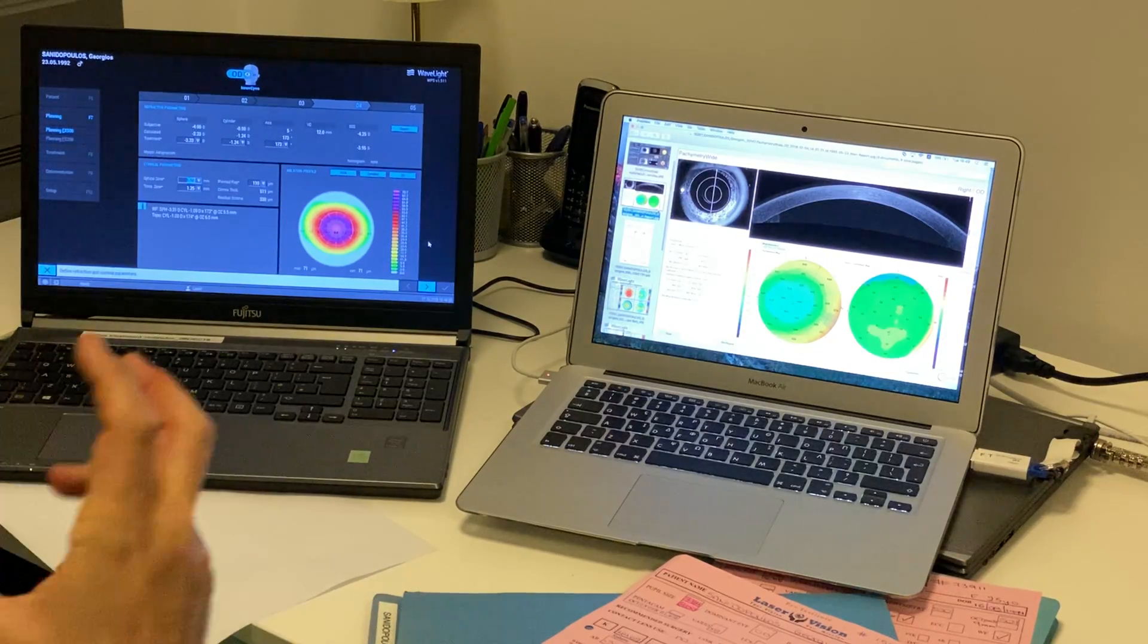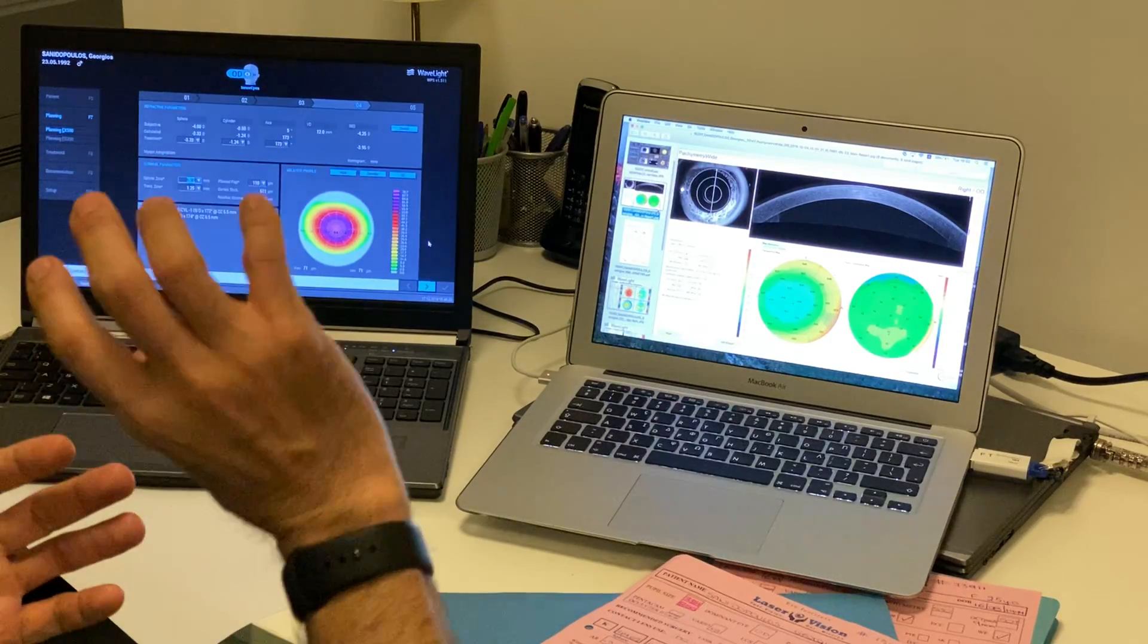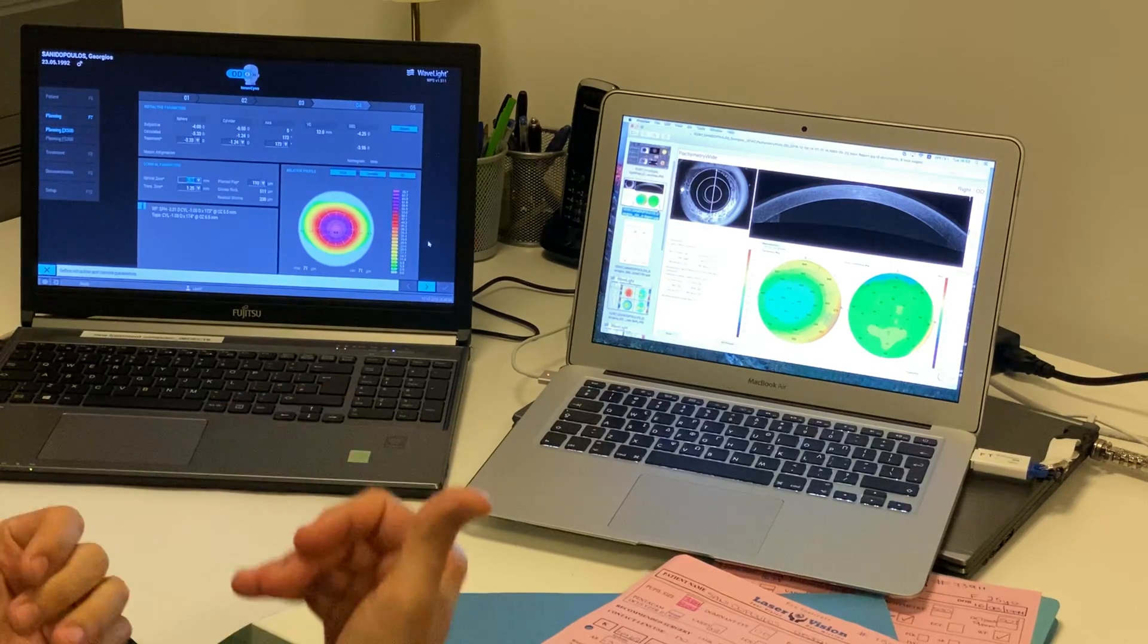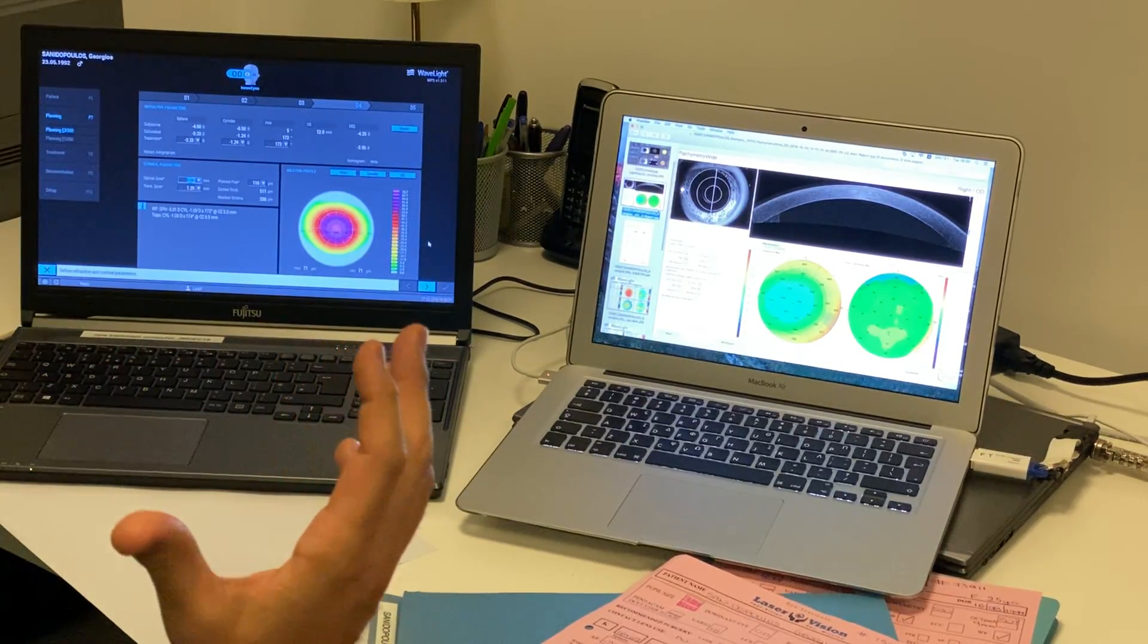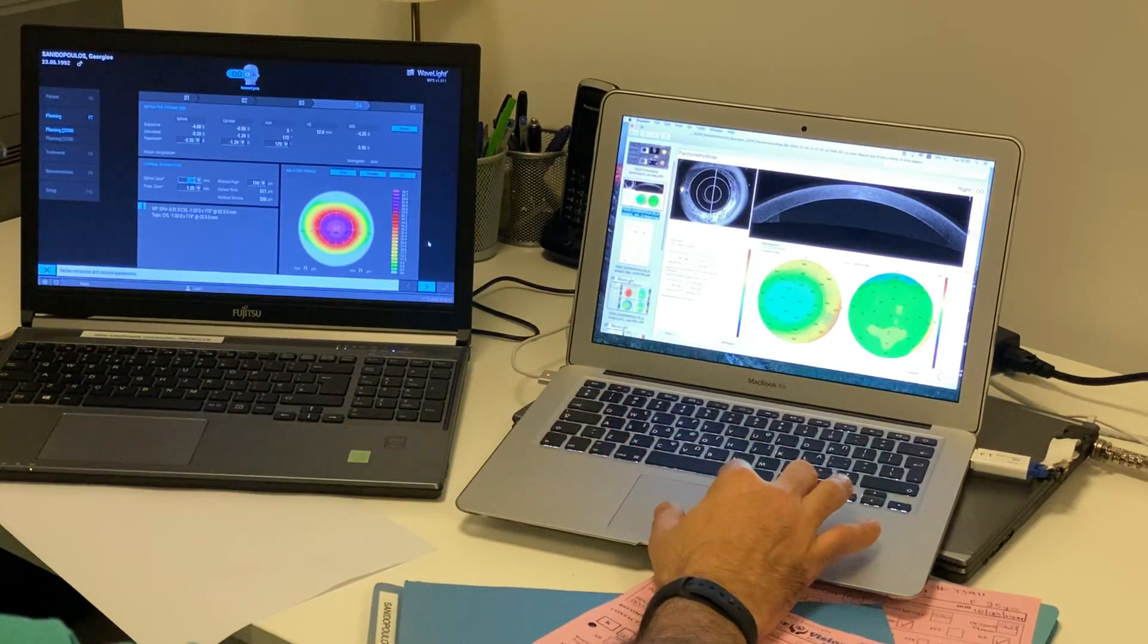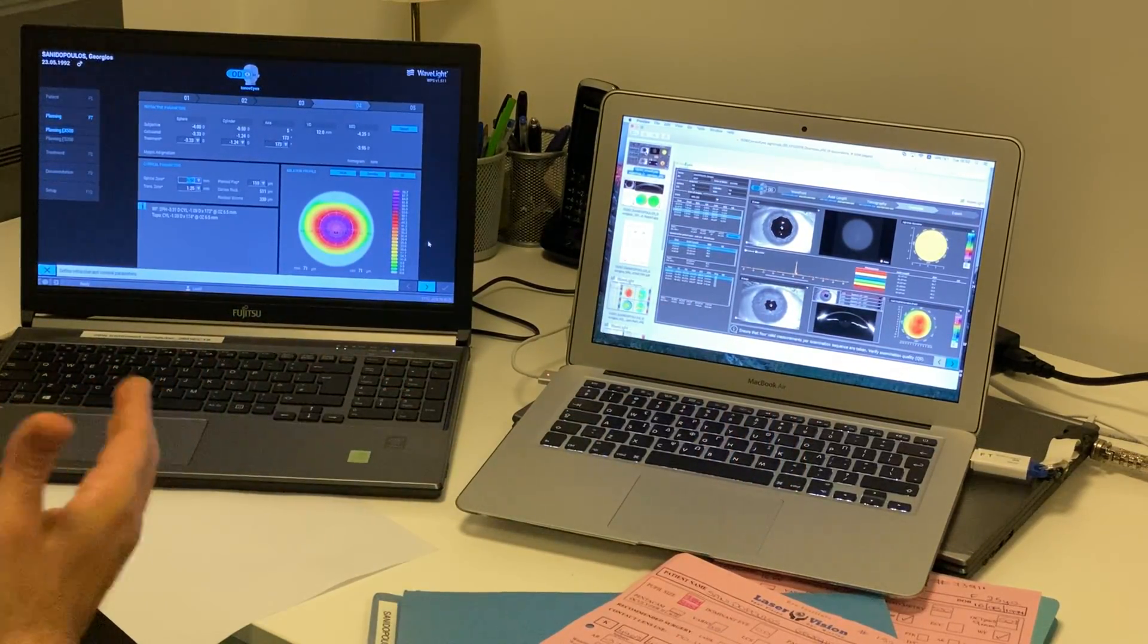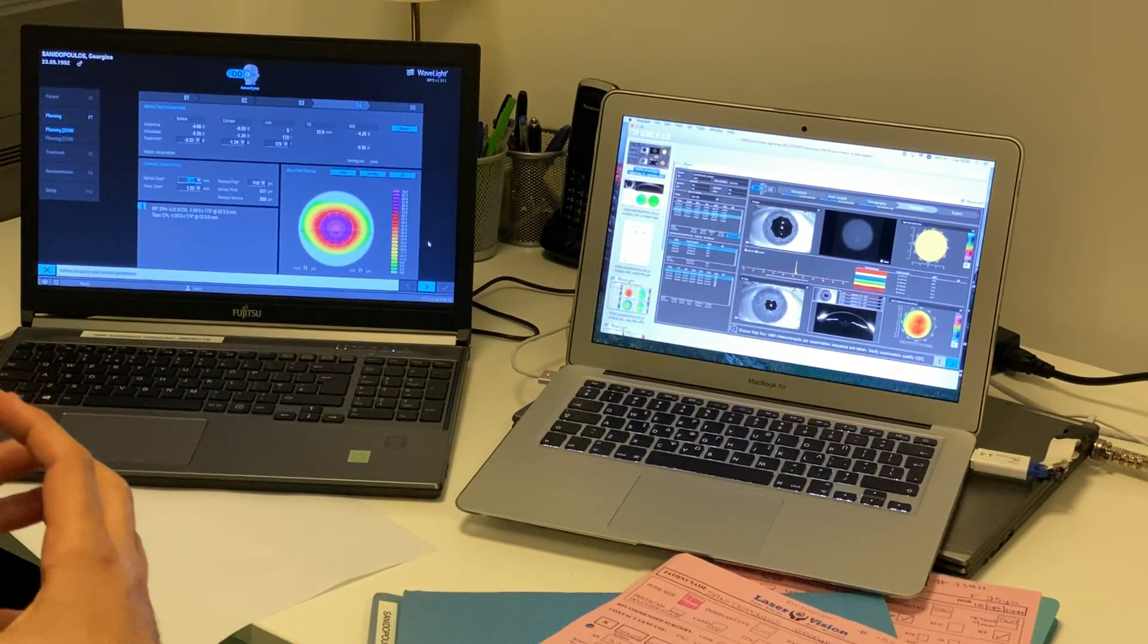And the sixth parameter is the iris registration data and the pupillometry that we saw before, which will be used to deliver this suggested treatment onto the exact location on the cornea guided by the possible rotation from cyclo rotation that the iris landmarks will have from the registration with the patient sitting to treatment with the patient supine under the EX500 excimer laser by Alcon Wavelight. It is mind-boggling that hours of assessment, of exam capturing, of debate, of looking into these numbers is now represented into a single multidisciplinary map that gives us all this feedback.